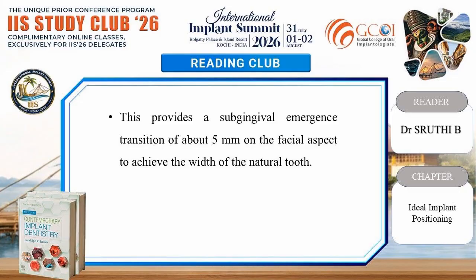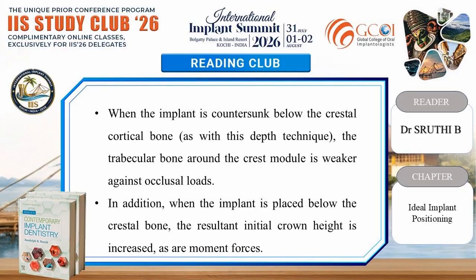When the implant is countersunk below the crestal cortical bone, as with this depth technique, the trabecular bone around the crest module is weaker against the occlusal loads. In addition, when the implant is placed below the crestal bone, the resultant initial crown height is increased, as are moment forces.